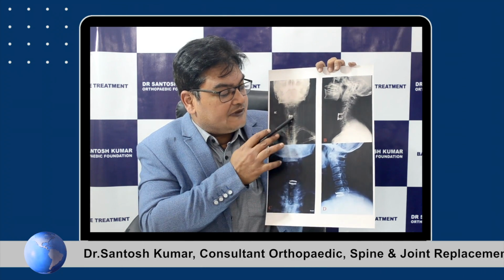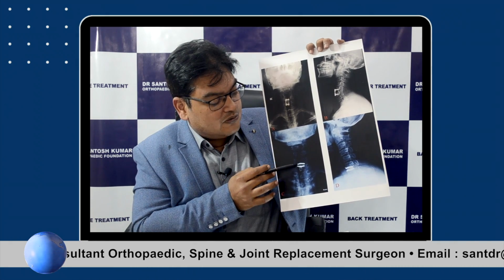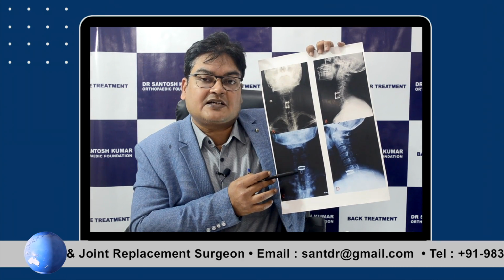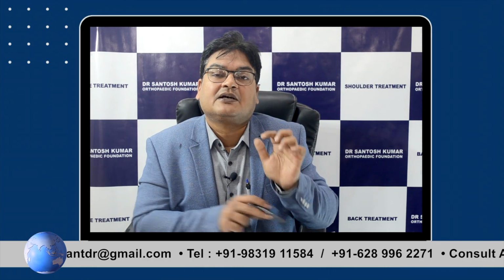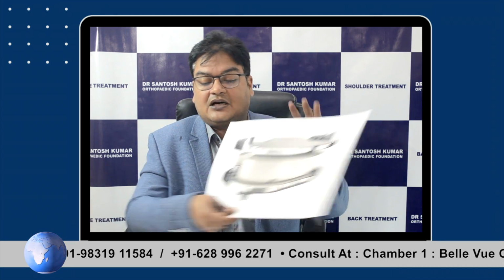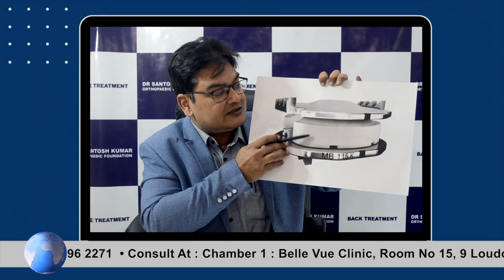And presently, where possible, if the criteria are satisfied, we go ahead with replacing the disc with an artificial disc material, which is known as disc arthroplasty. Now the advantage of disc arthroplasty is that it doesn't fuse that particular segment. So it allows movement to take place. That is the advantage. Now this is how a cervical disc arthroplasty looks like.